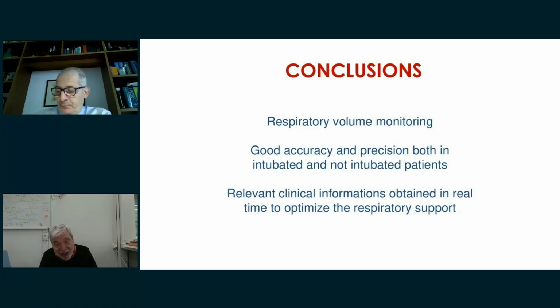And the motor is how much negative pressure you produce in spontaneous breathing. Remember the slides in which I put the contraction of the muscles, PMUS, and so on. I think it's important to understand what we are talking about, in which part of the field we are. So once again, measure.